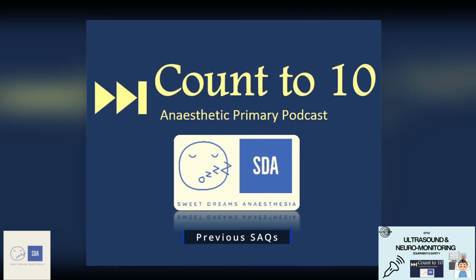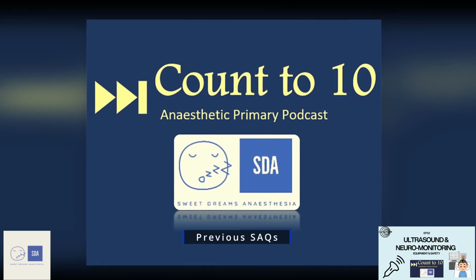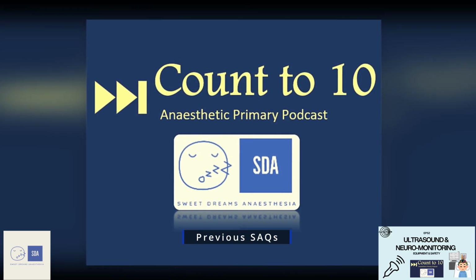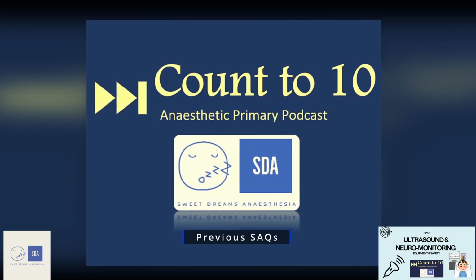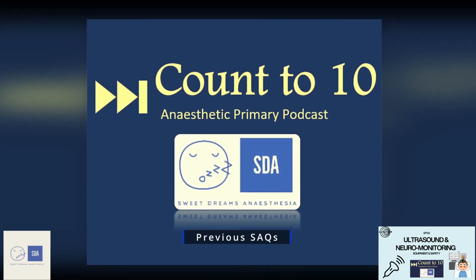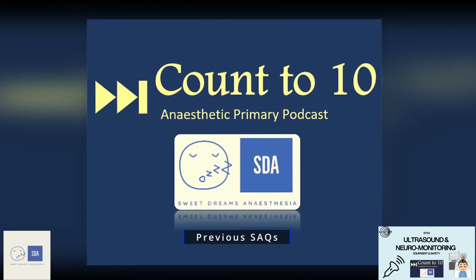So to answer this question, when I think of my model answer, I interpret this question as having two different parts to it. There's the part of cardiac output, and then there's the Doppler effect part. So for both these parts, I have a separate definition. For cardiac output, the definition is heart rate times stroke volume. And within this, you can say that the heart rate can be calculated clinically using ECG or by visualization of the heart on TTE ultrasound.